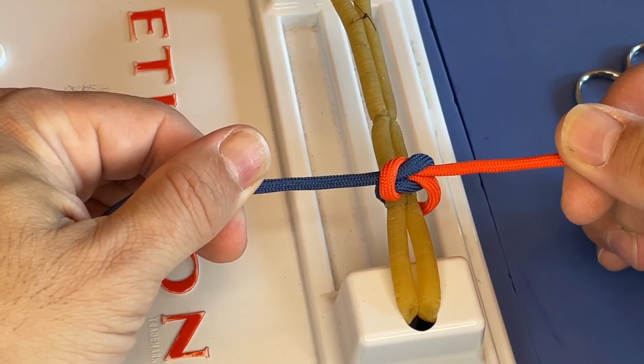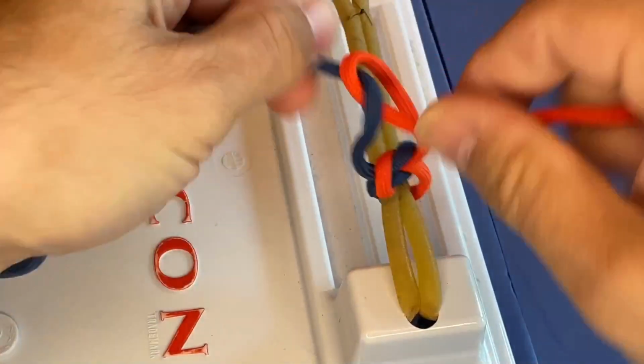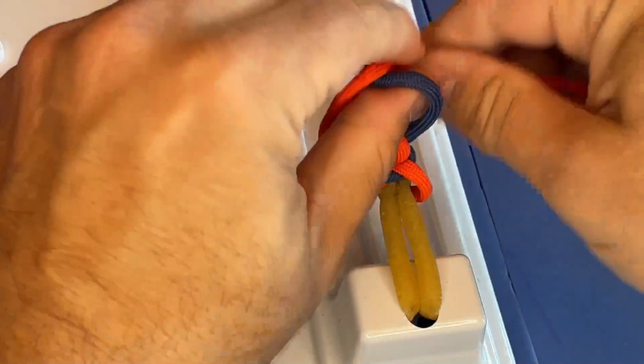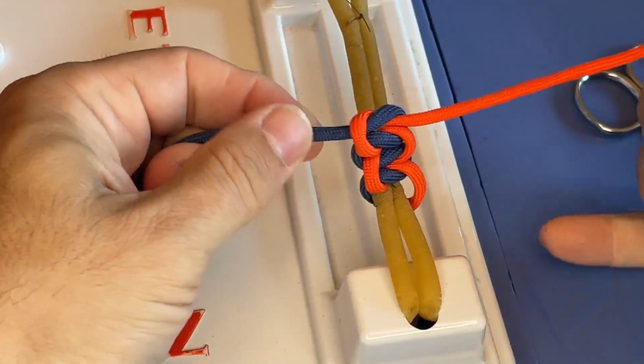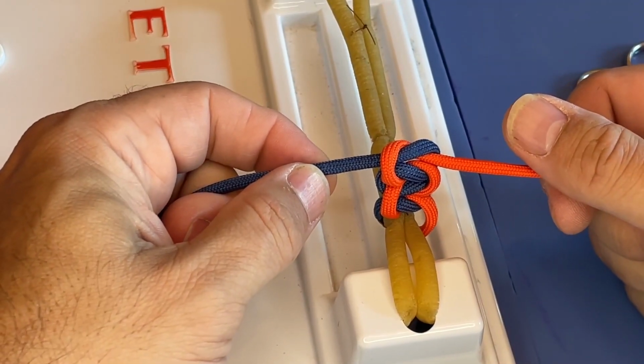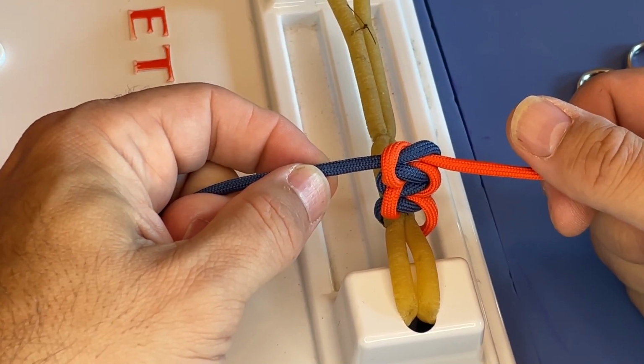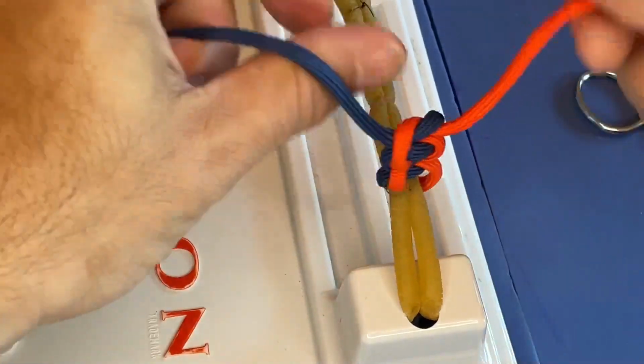The first 2 throws that you do complete 1 square knot. So then it's just back to it, over the thumb, lay that down, over the finger, lay that down. So now we have 2 square knots. So if this were a monocryl, I do 4 throws, 2 complete square knots for monocryl. If it's a vicryl, same thing, 4 throws for that.